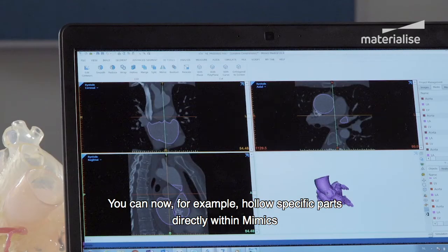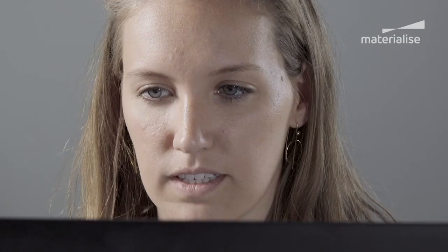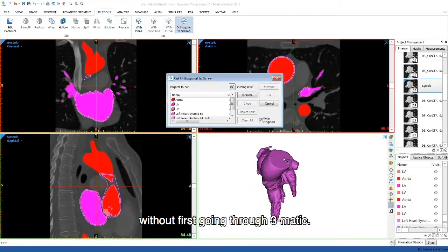You can now, for example, hollow specific parts directly within Mimics without first going to 3-matic.